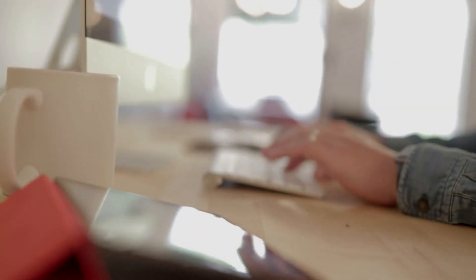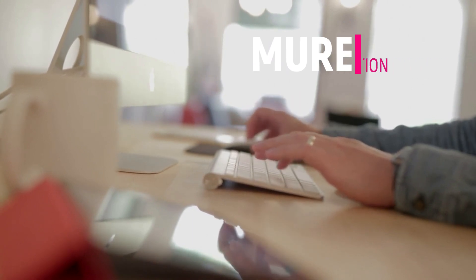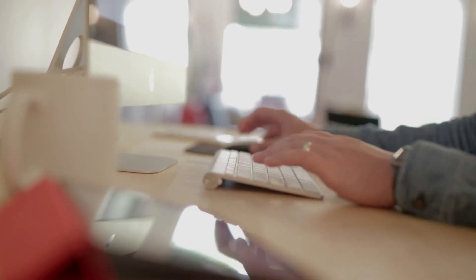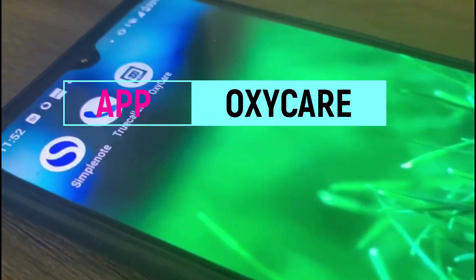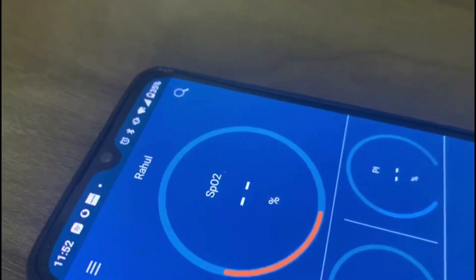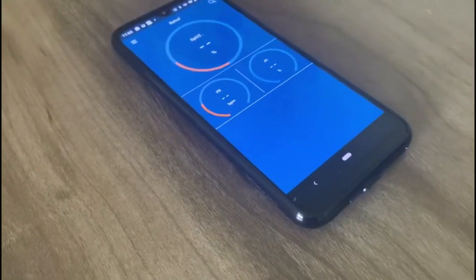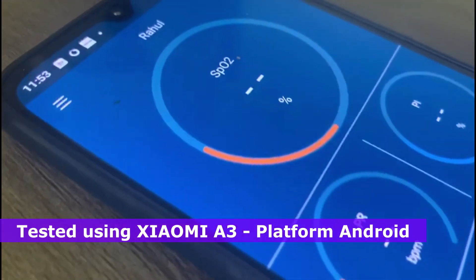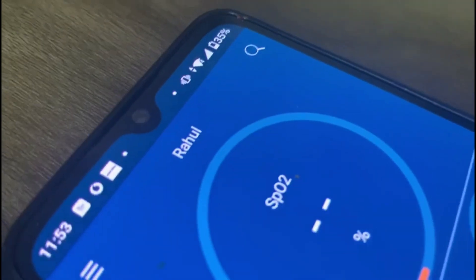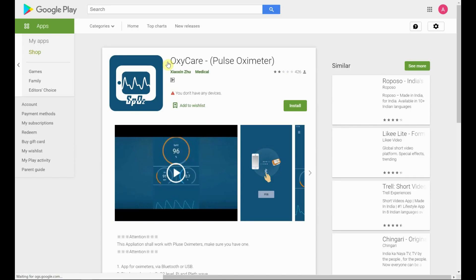Today we are reviewing the OxyCare app from the Google Play Store. The OxyCare app is being reviewed using the Bluetooth Control D Oximeter. This is a freeware app available both for Apple and Android devices. This has been tested on my Android mobile phone, Xiaomi E3. In my Control D Bluetooth Oximeter, I find in the instruction manual to use the OxyCare app. A quick search on Google will take you to the OxyCare app on the Google Play Store.